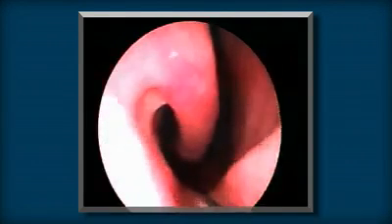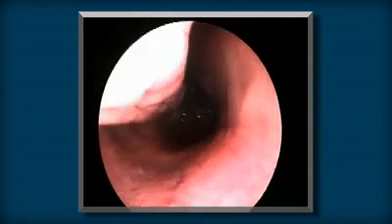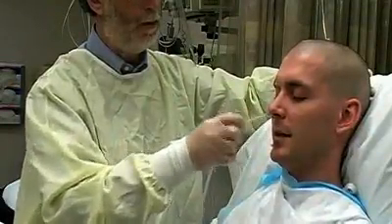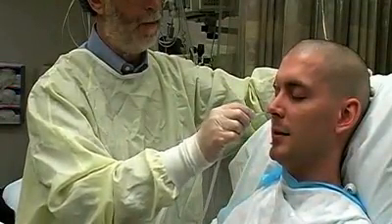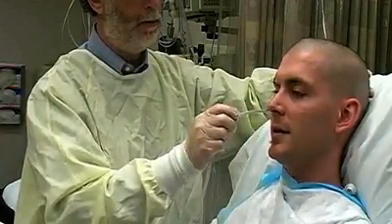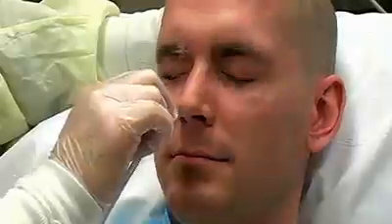Note that when the tube is directed correctly along the nasal floor, it easily passes underneath the inferior turbinate and onto the posterior nasopharynx. You'll feel resistance when the tube reaches the posterior wall of the nasopharynx. Stop here and allow the patient to rest before you push the tube around the corner into the pharynx. This part of tube insertion may be quite uncomfortable despite adequate anesthesia. Now advance the tube with steady pressure until it turns the corner into the posterior pharynx, which is indicated by a decrease in resistance. The patient may begin gagging. Now you are ready to advance the tube into the esophagus.